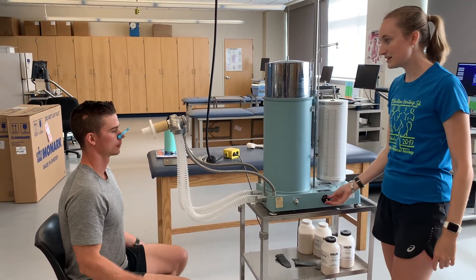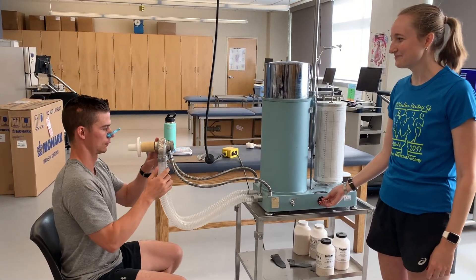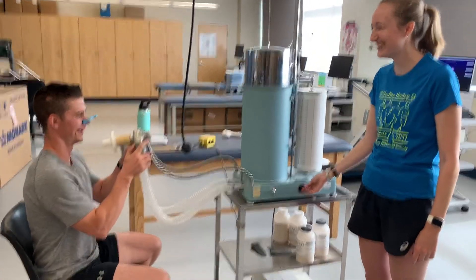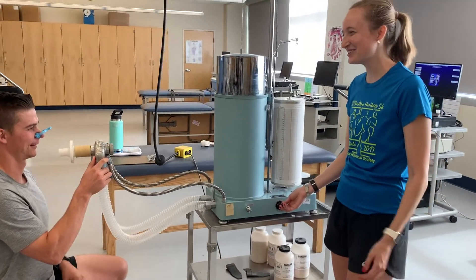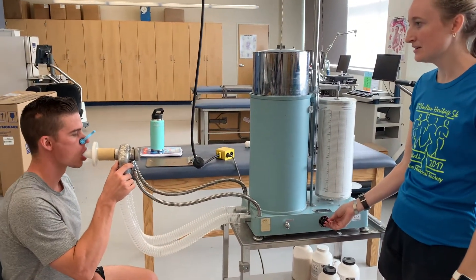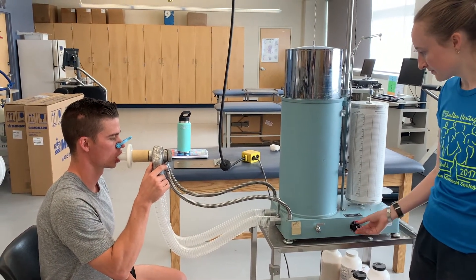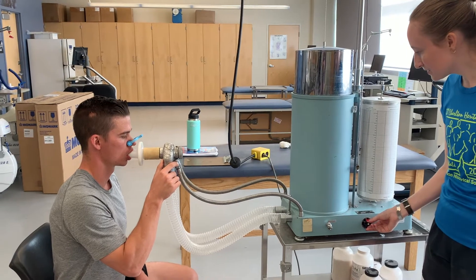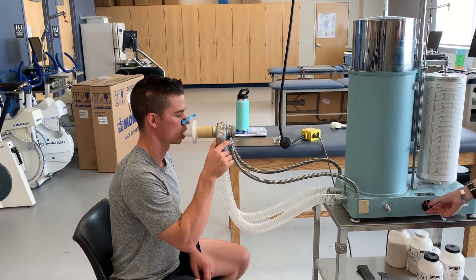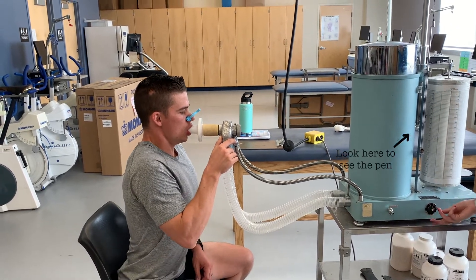Go ahead and put those nose clips on, and we'll push the pen up against the paper so we know it's recording. Whenever you're ready, go ahead and go on that mouthpiece — you can hold it with one hand if you need to. Start with just those normal inhales and exhales, and whenever you're ready go ahead and breathe all the way in, fill those lungs all the way up.